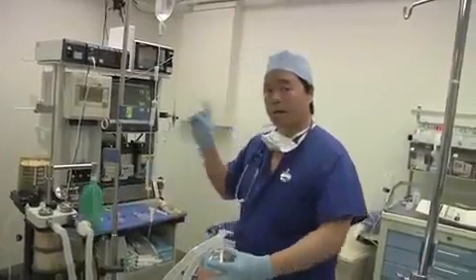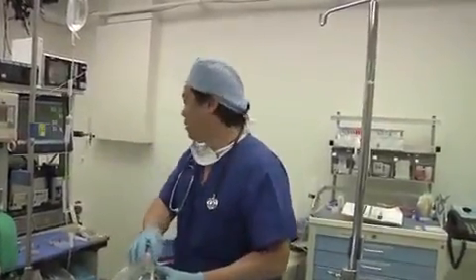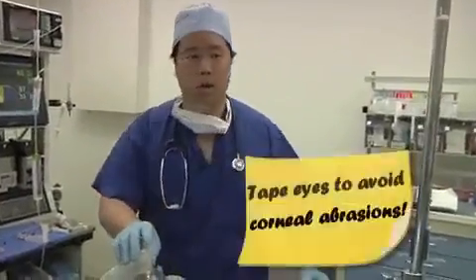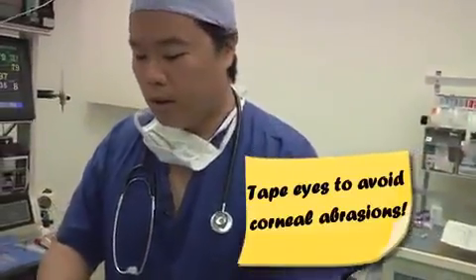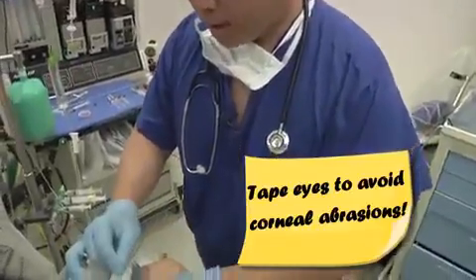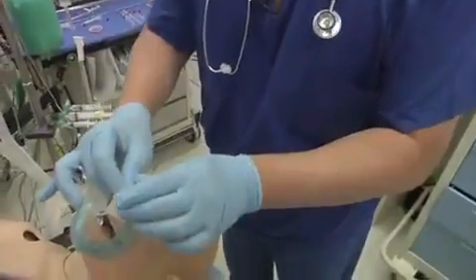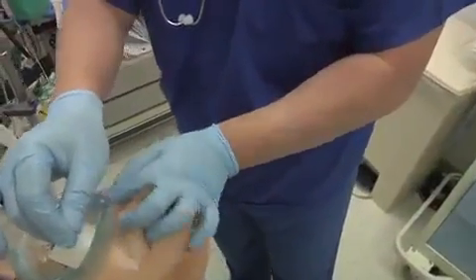There's another important thing I will mention, which is taping the eyes. It's very important to tape the eyes because you can inadvertently cause corneal abrasions if you don't adequately protect the eyes by taping them shut. And this is something that we discussed previously in our intubation lesson.